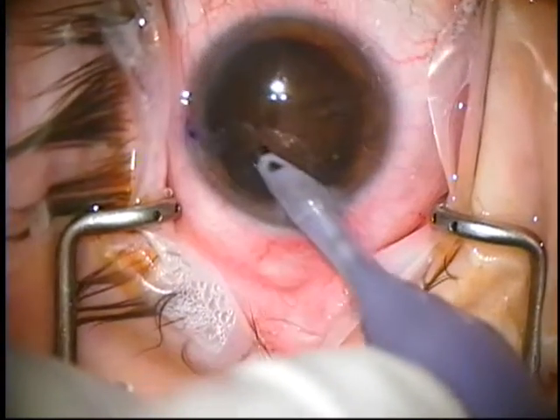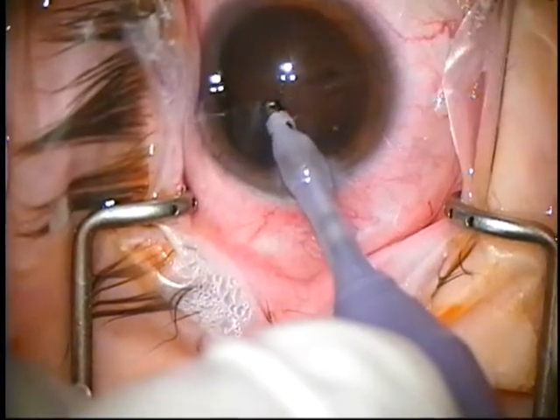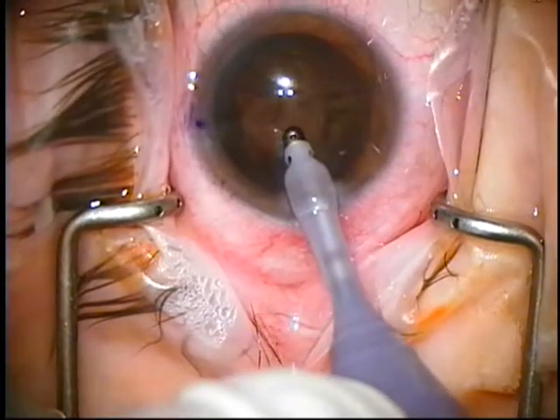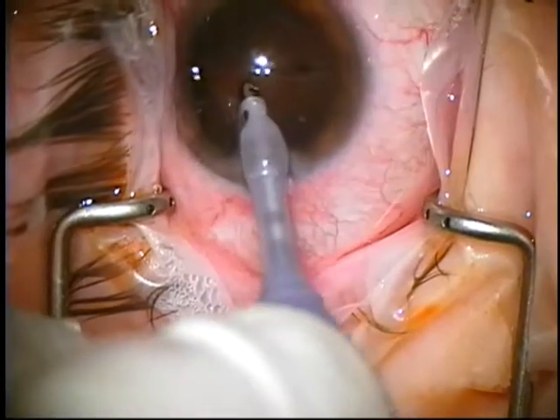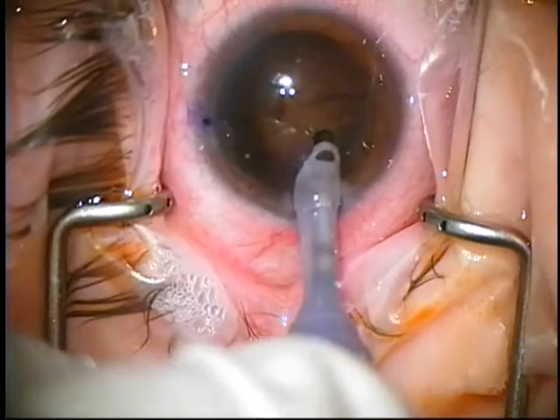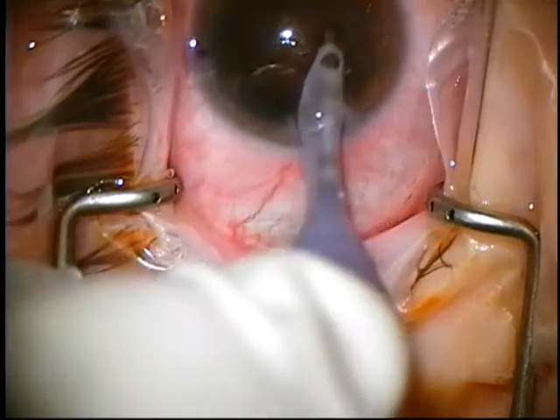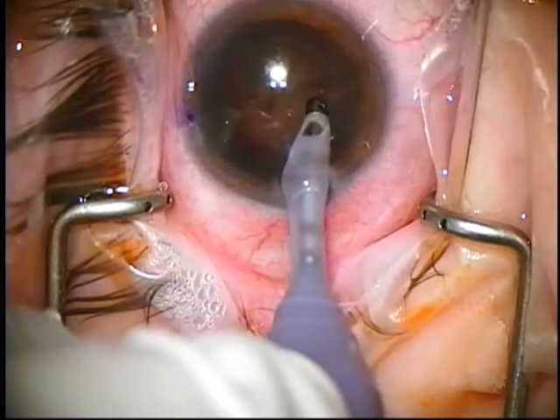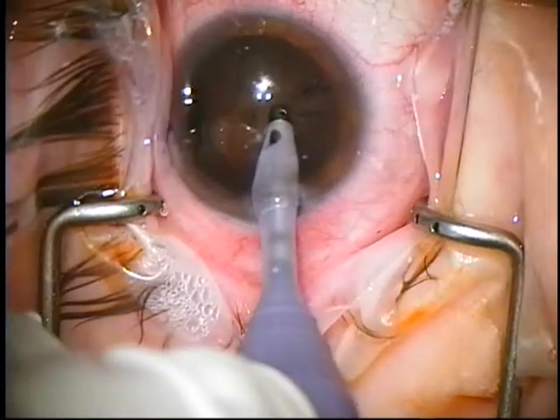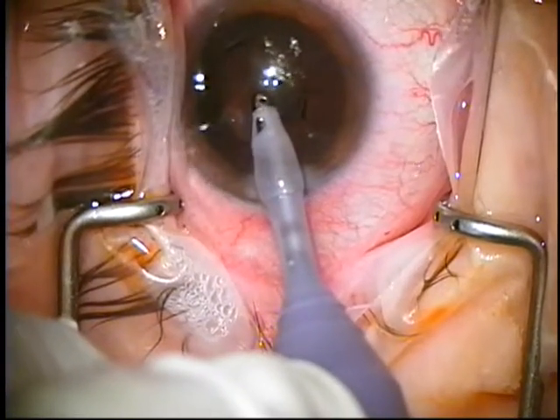I'm filling the port with the anterior leaflet. When I am lurching to separate it, I pull with the port up radially. Then we're going to go to the other side. The port goes right where the anterior leaflet is. Under very slow aspiration, I'm lurching, separating it. I'm turning the port up, coming down on my foot power and teasing this. Don't pull upward — I'm staying very radial. I pull horizontally.